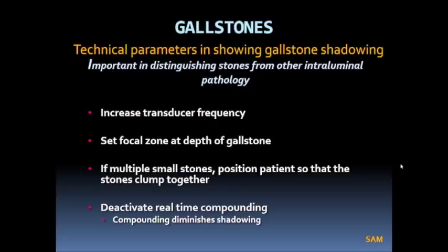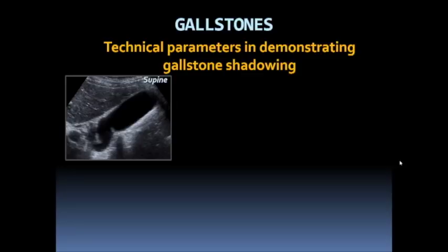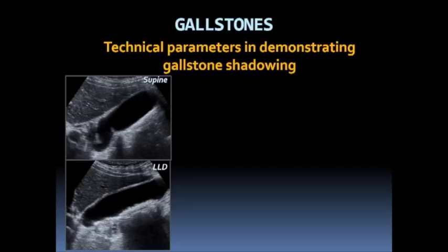Here's a patient scanned in the supine position where the lumen looks clear, or at most you might see a faint straight line indicating stones but no shadowing. The same patient turned into the left lateral decubitus position shows those stones clumped together with clear posterior acoustic shadowing. Without a doubt, we can confirm this patient has multiple small gallstones.